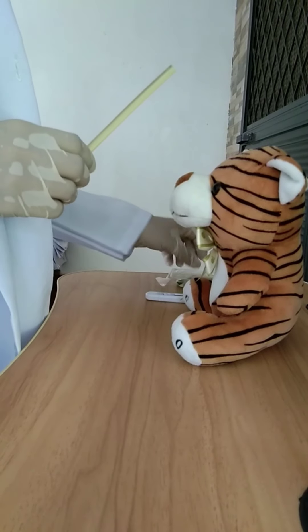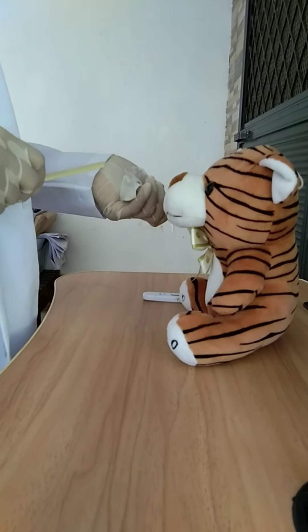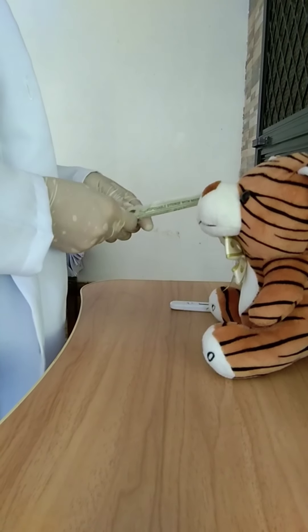Insert the swab into the culture tube, taking care not to touch the top or outside of the tube. Crush the ampoule at the bottom of the tube and make sure that the top of the culture tube is secure.